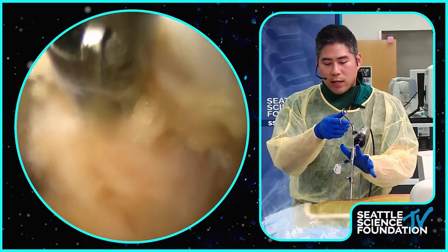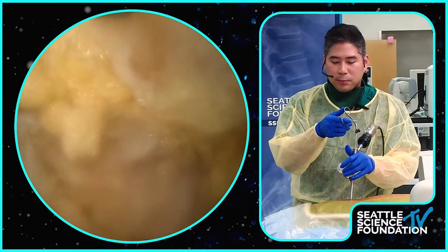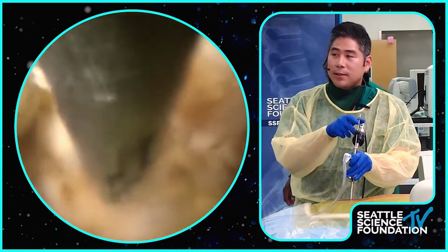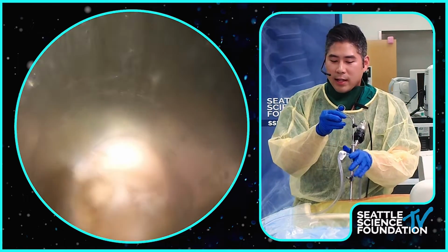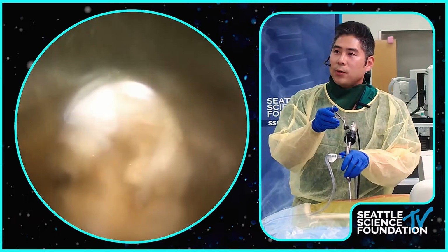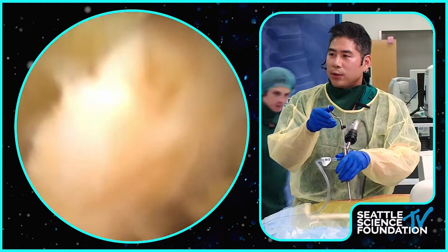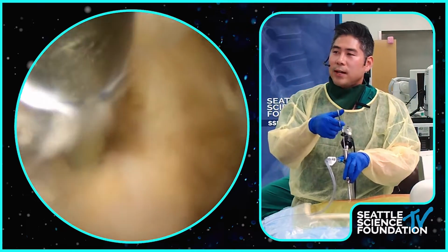So what I usually do is hold the endoscope between the thumb and the index finger, and I swing the irrigation to the opposite side. So my hand is kind of comfortable and free. And then using my finger, I can control the scope, so I can rotate. If I want my bevel to be open, I can rotate it this way. If I want to look inferior or lateral, this gives me enough degrees of freedom.